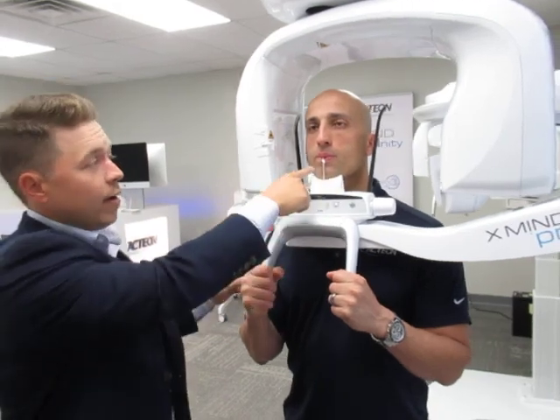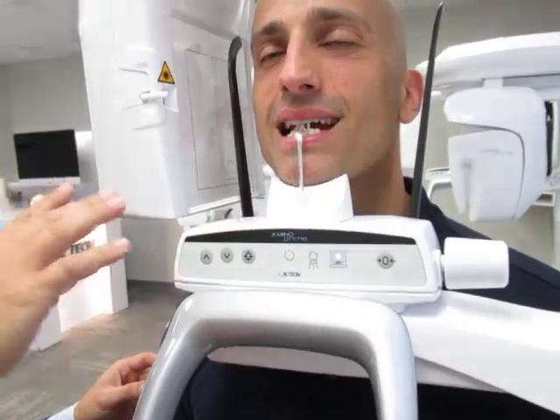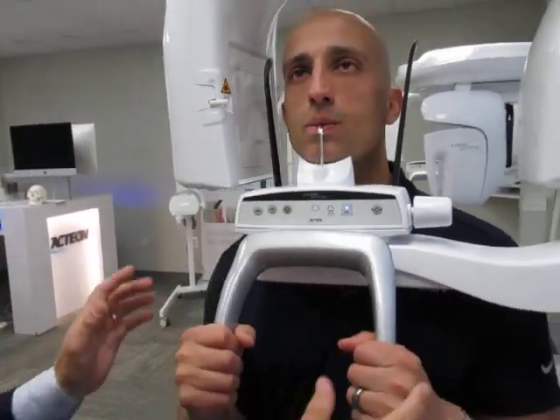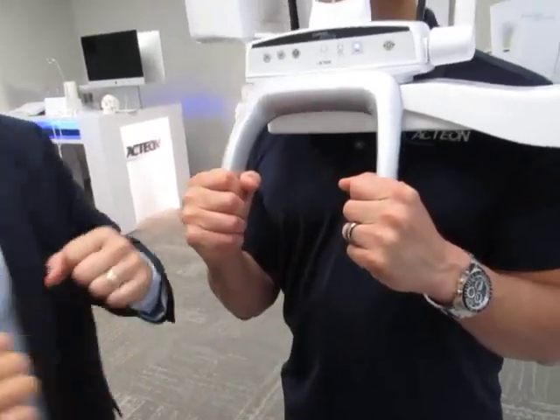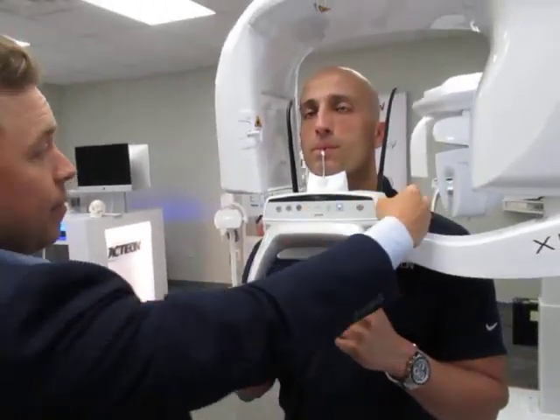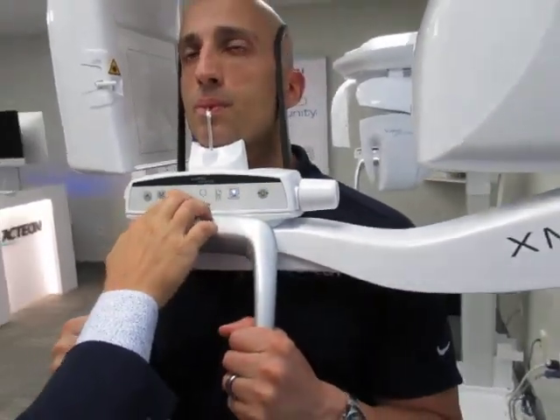bite stick. It's very important, please smile, that he has his teeth in the middle of those notches, not forward or backwards. I'm going to make sure his hands are on the bottom of the handlebars here so that he's nice and straight and doesn't move. And then I'm going to come in, I'm going to tighten the temple rods and turn on the laser.